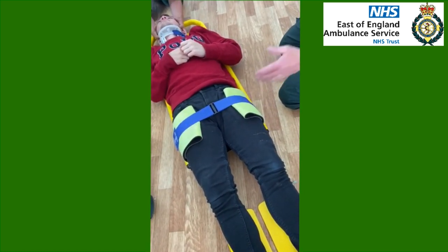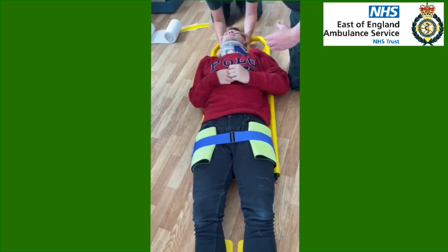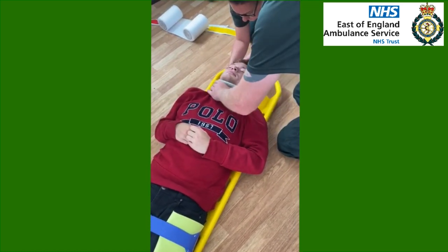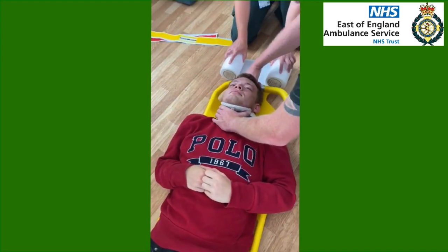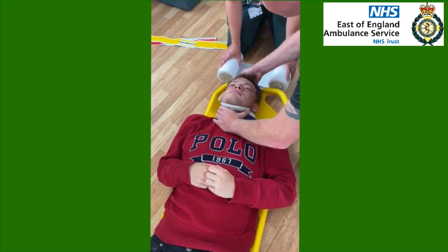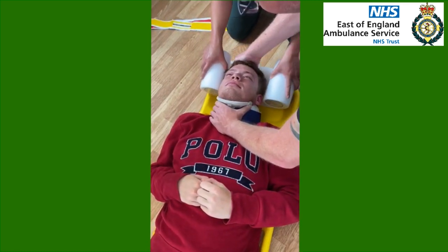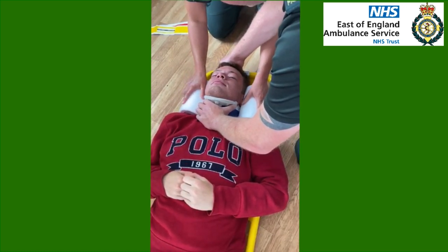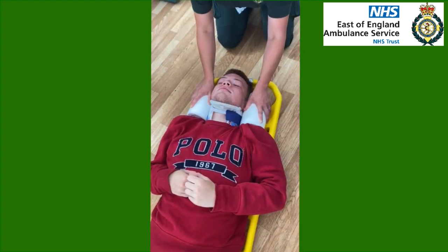Now we need to concentrate on C-spine. We have the new head locks. I'm going to take C-spine on the chin at the top of the head to allow Sarah to free up — I'm on, I'm off. We'll pop the blocks, get them sized up. They fit all sizes of adult and paediatric. We slide it gently, maintain C-spine position underneath the head, and go down as far as we can towards the shoulders. If you have control, you're on, I'm off.